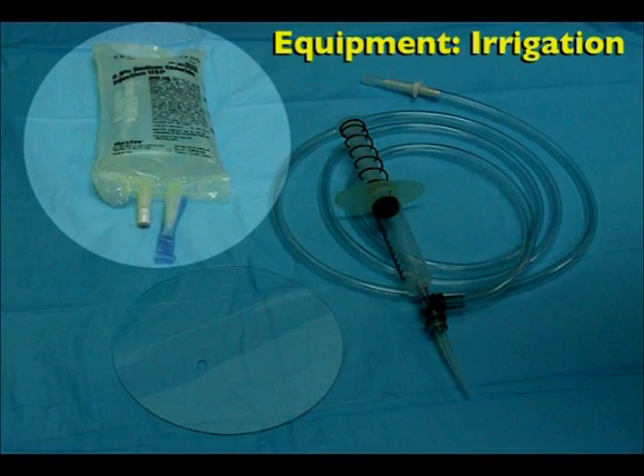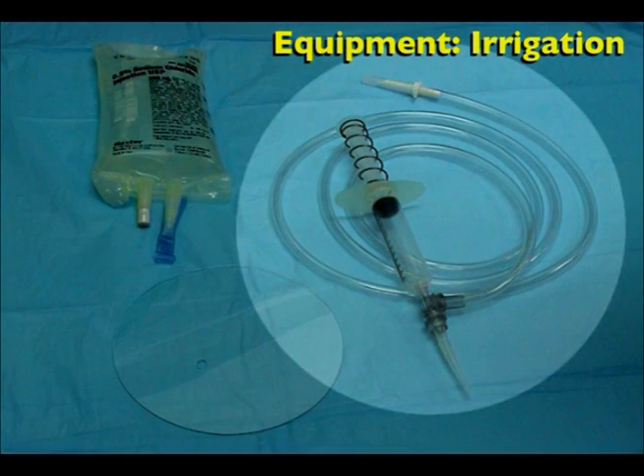Irrigation equipment includes a bag of sterile saline, an irrigation syringe with tubing, and a protective shield.